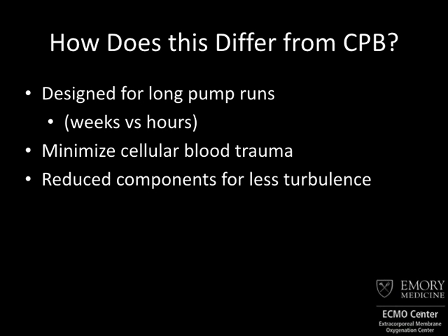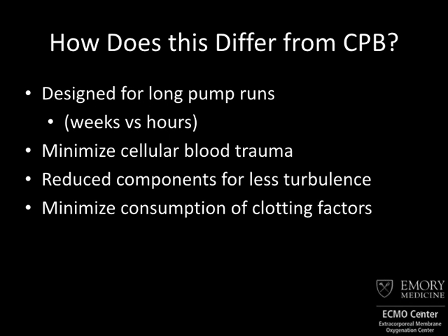How does this differ from what we use in the operating room, I think is the fundamental question. And the answer to that is it doesn't differ all that much, but there are a few novel things with it. First of all, everything on an ECMO circuit is designed to last for weeks. In the OR, we're expecting it to last for maybe hours. And so we really have some fundamental changes to the circuit that aren't really blatantly obvious, except for one of them. But everything in the circuit's designed to minimize blood trauma.